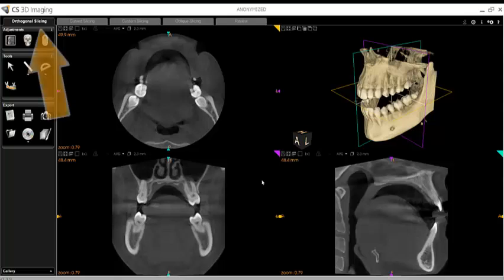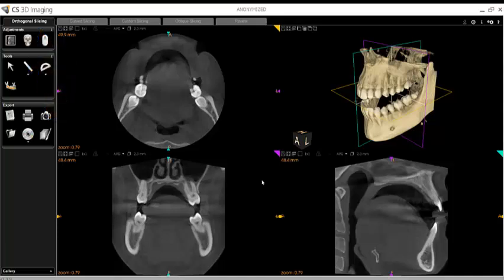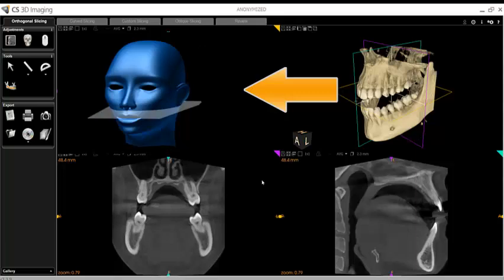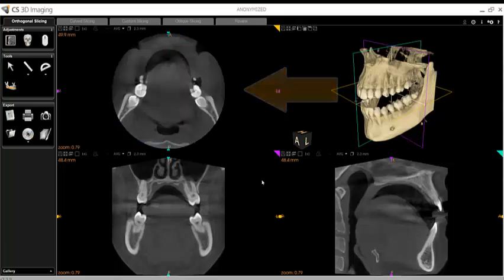Once the scan is open, it will likely default to the Orthogonal Slicing tab. This tab gives a great overview of your patient's scan from all of the different planes. In the upper left, there is the Axial Orientation, which allows viewing of the volume bottom to top, top to bottom.